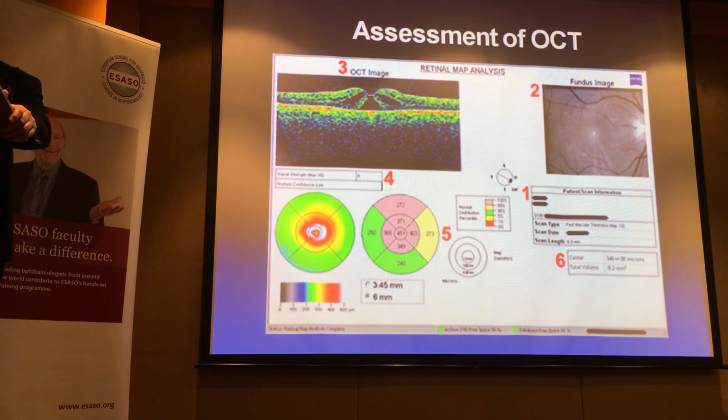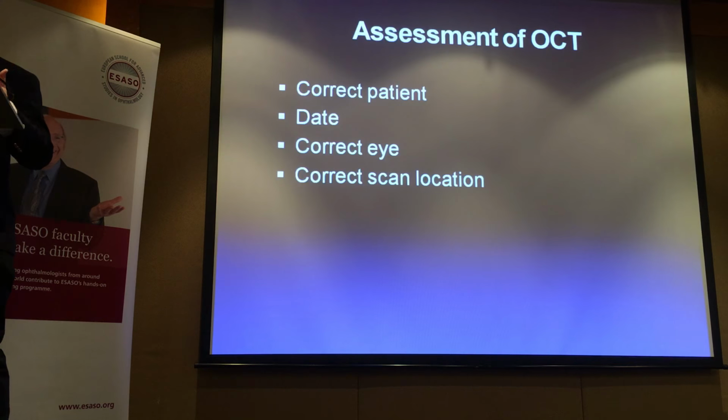So just to summarize, please make sure the correct patient is done on the correct date, correct eye obviously, and the correct scan location. Correct eye, first of all, you could be looking at the wrong eye. Maybe I'm just not that bright, but sometimes in clinics, it's like, which eye are we talking about?